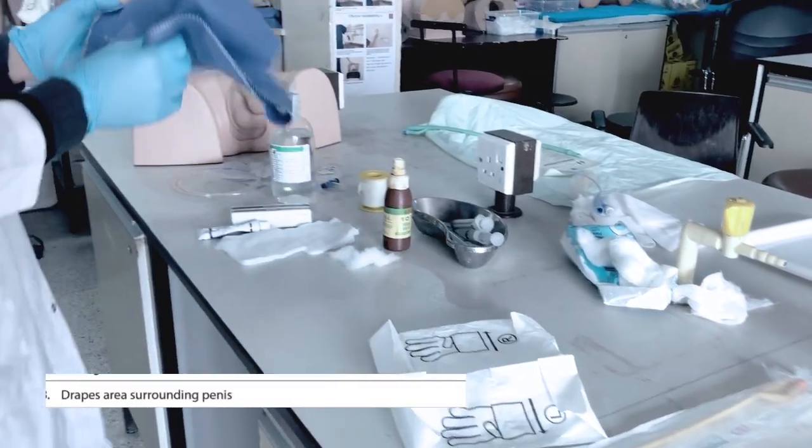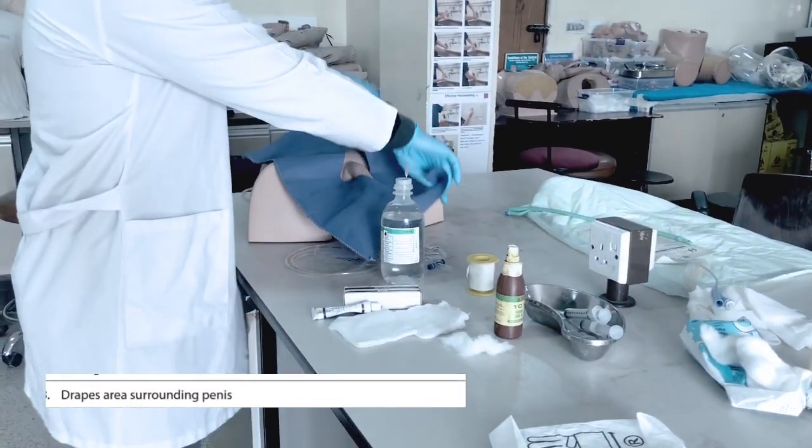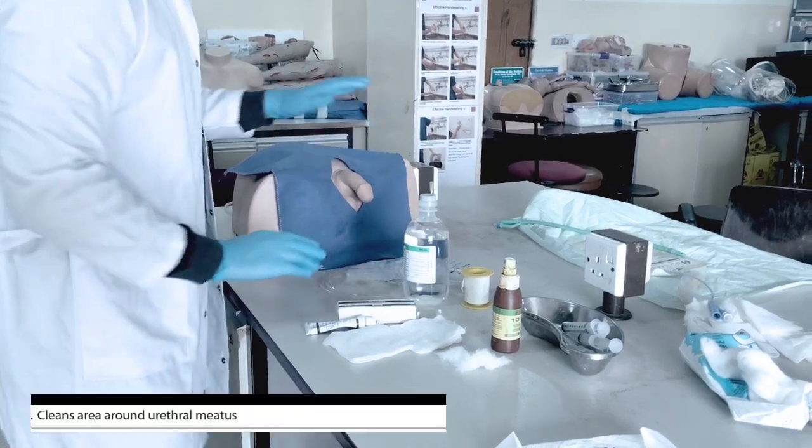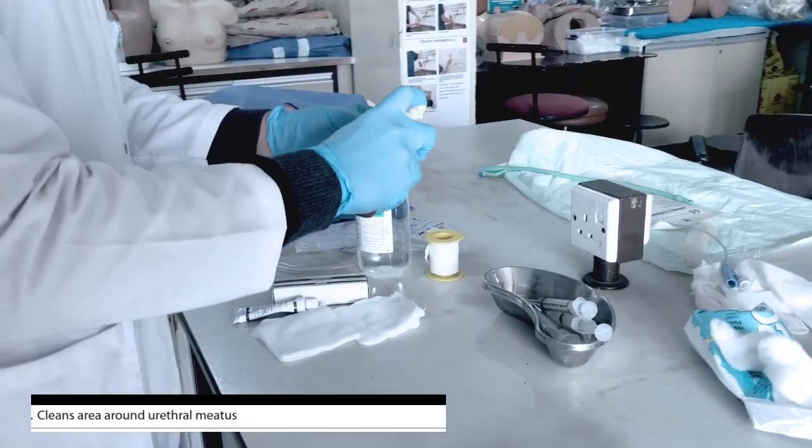Then we cover the other exposed area around the penis. Then we clean the area around the urethra meatus.